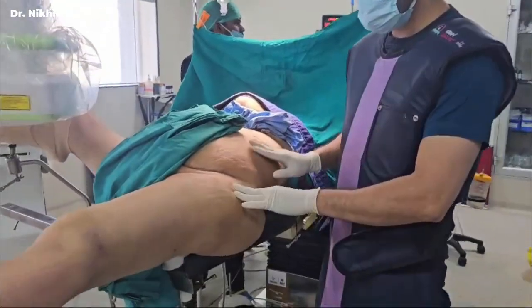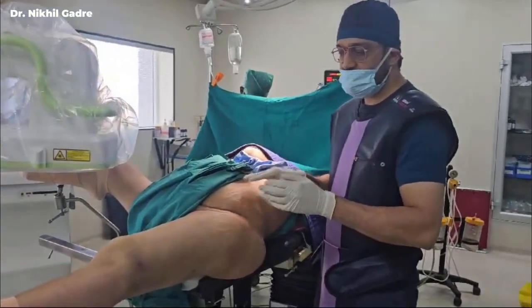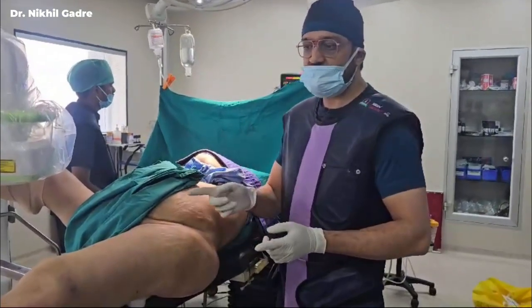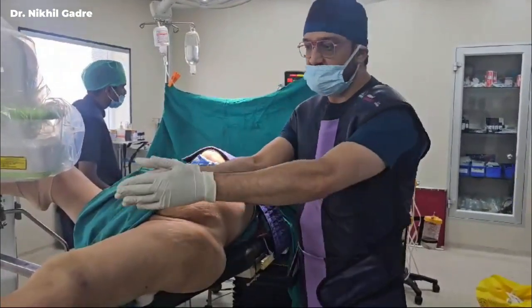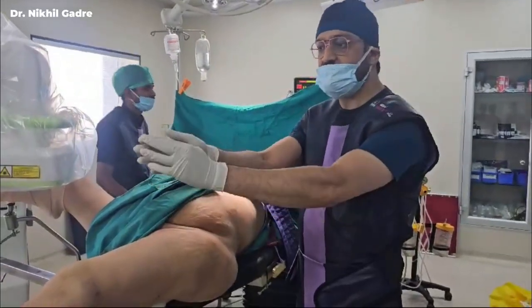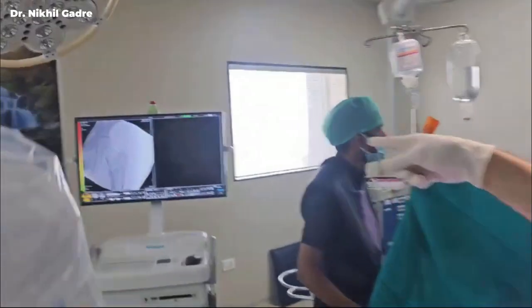Now the reduction maneuver in IT fracture is very important. The proximal fragment is always flexed, abducted and externally rotated. So the initial traction I apply with the distal fragment in flexion, abduction and external rotation. Then I adduct and internally rotate. On the AP view, this is the reduction which you should obtain.